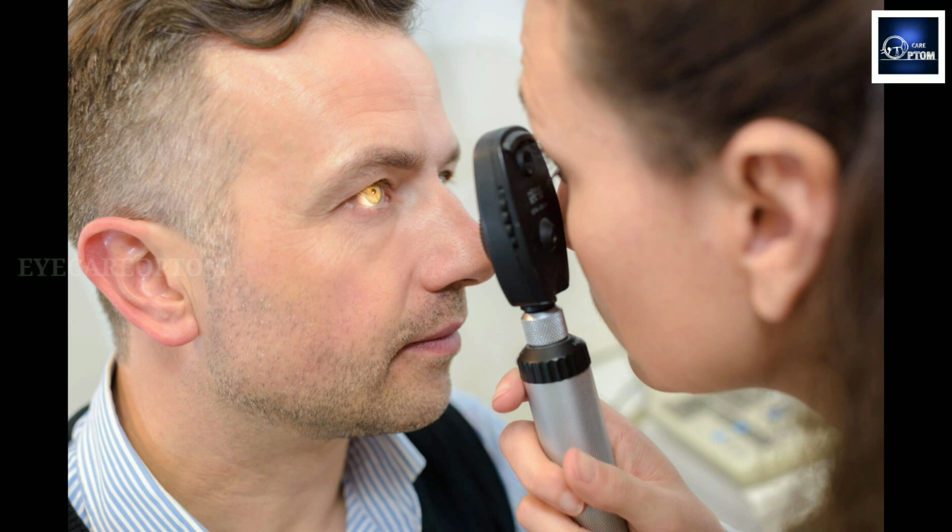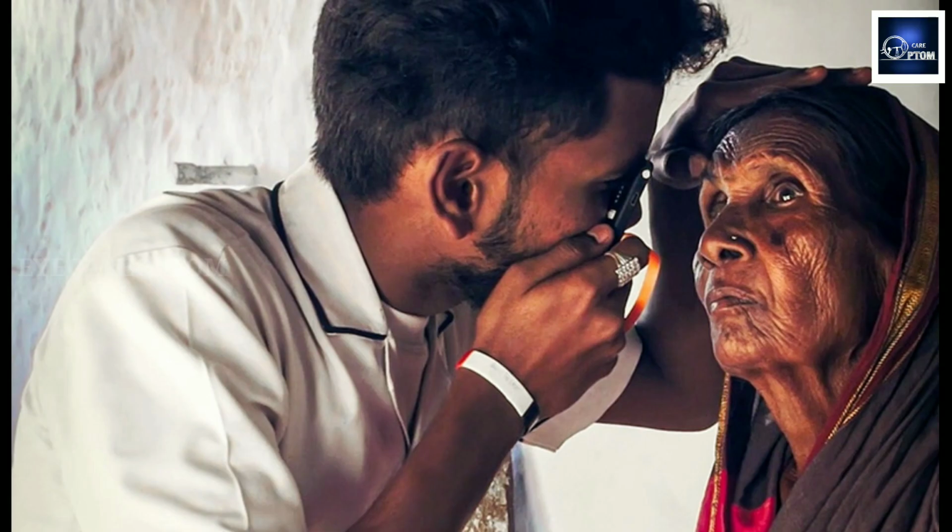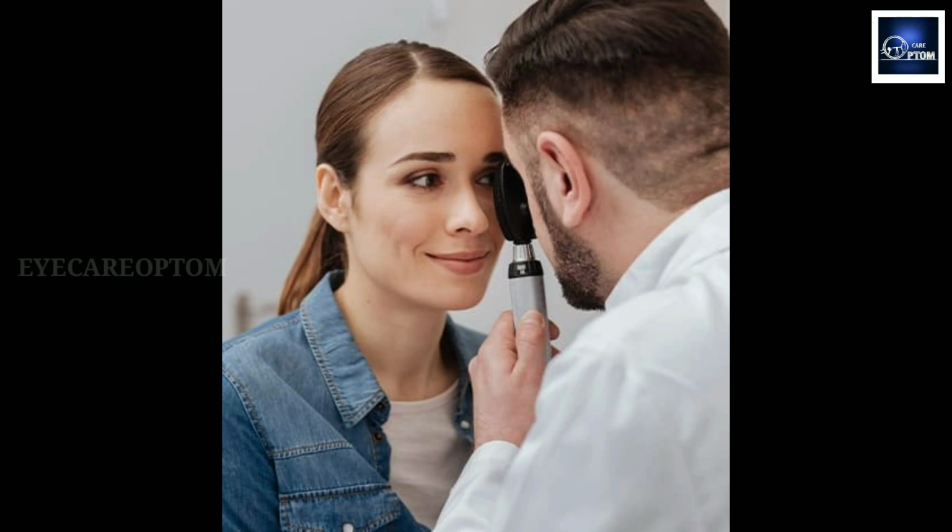If you are checking the patient's right eye, you should hold your instrument in your right hand. Stand towards the right side of the patient and use your right eye to see the fundus. Same for the left eye, everything will be done on the left side.